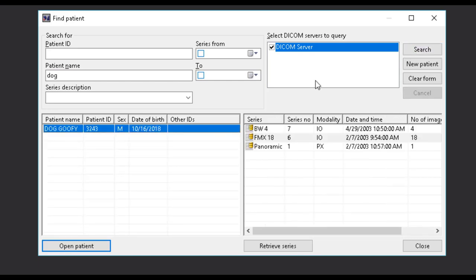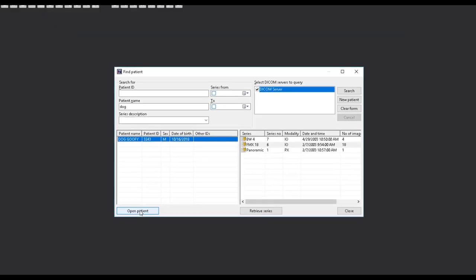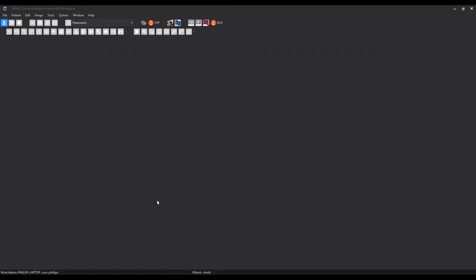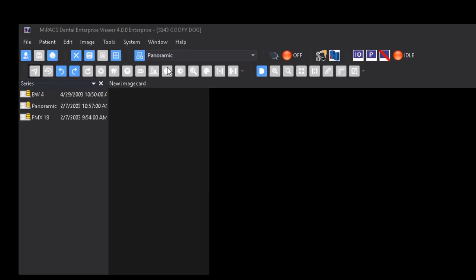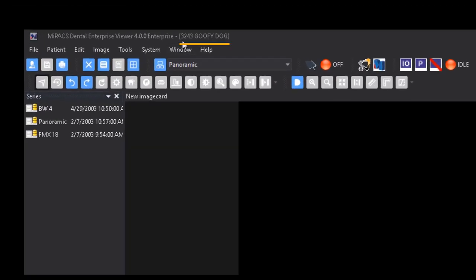You may then select the correct record from the results window and select Open Patient to open the record. Once the patient record is open, you will want to ensure you have the correct patient open by looking at the title bar at the top of the screen.